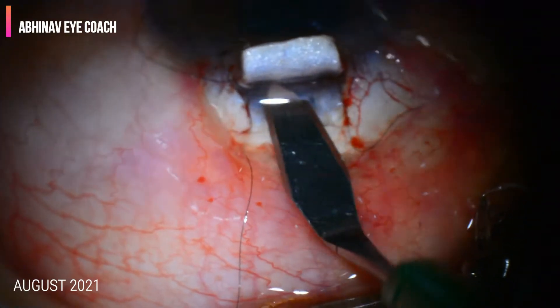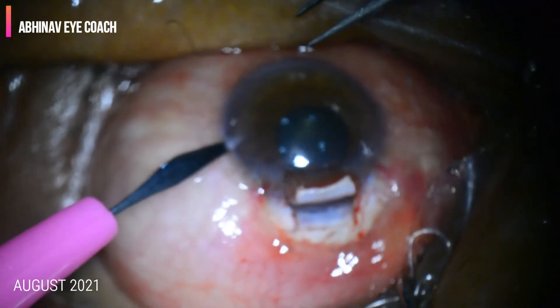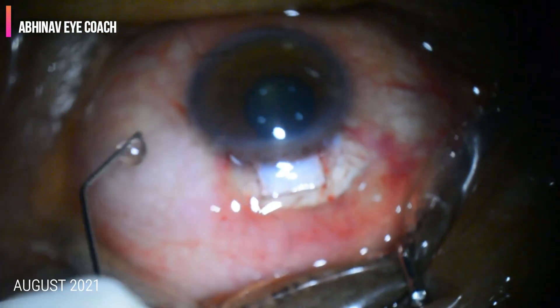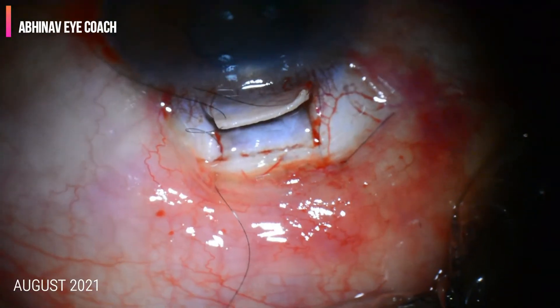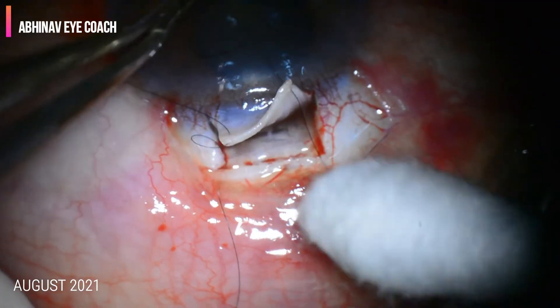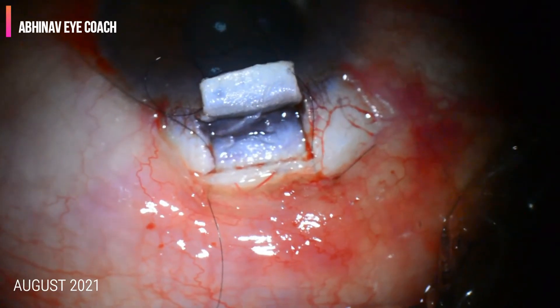After entering the anterior chamber, we feel the aqueous gush. A paracentesis is made to maintain the anterior chamber, so that we can push balanced salt solution into the anterior chamber and keep the anterior chamber formed with the help of that side port.